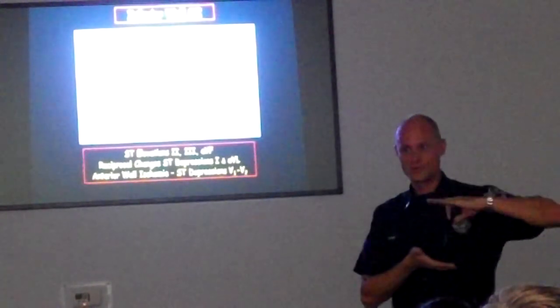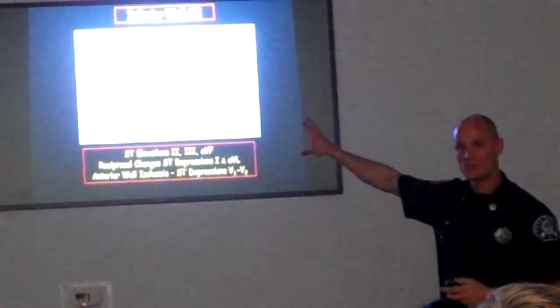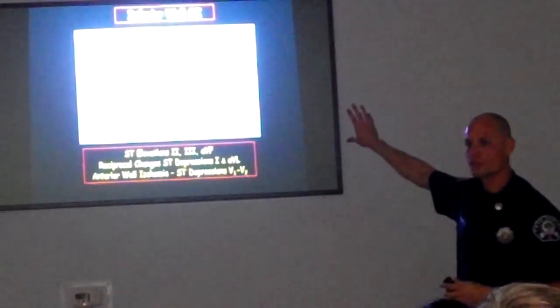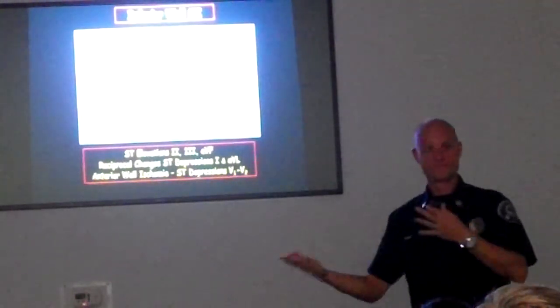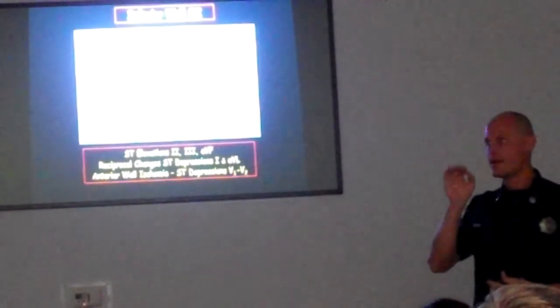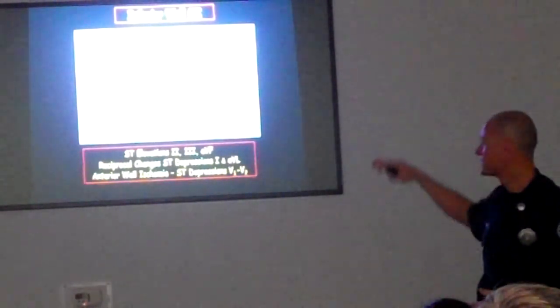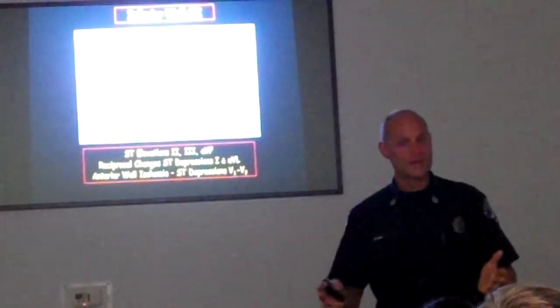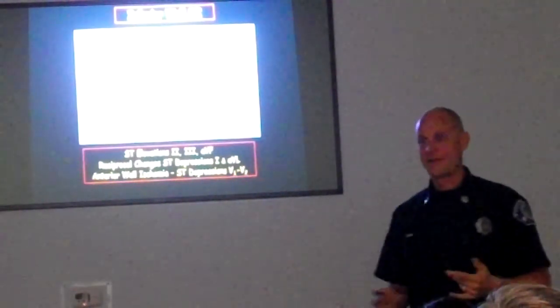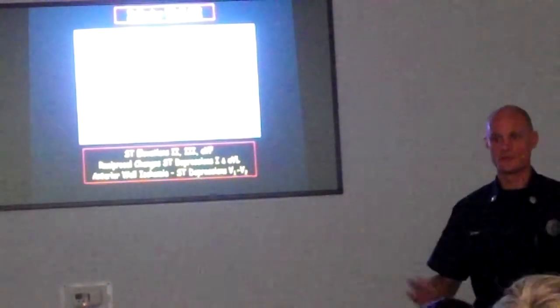So you get a reciprocal change in a different portion of the heart. If you have ST elevation somewhere, you're also going to have ST depression somewhere else, because it's a mirror image. That portion of the heart is getting less oxygen, so you're getting ST depression somewhere else. It doesn't matter for our purposes. Just remember reciprocal changes, super fancy word, mirror image. That's all it is.